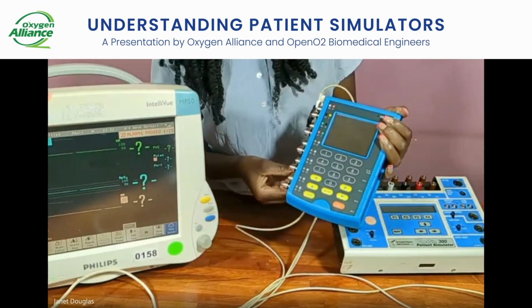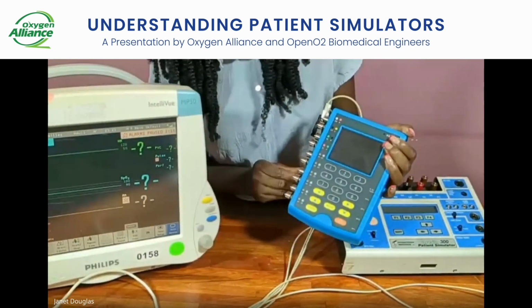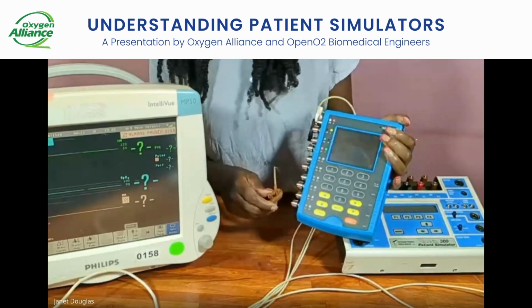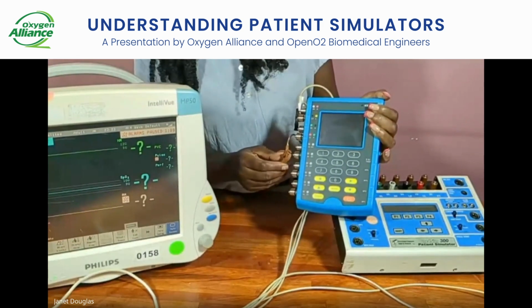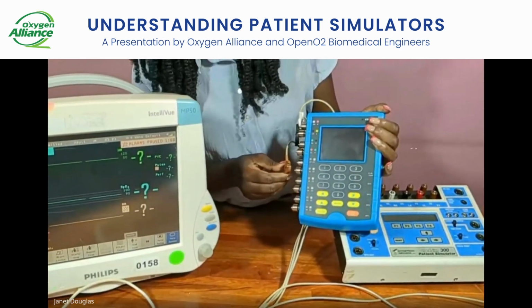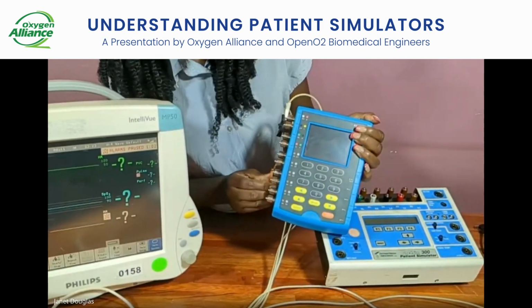The brown one, also it's V, and I'll check as well where it's labeled V. So we have V1 up to V6, which is just showing us different sides of getting the signals when you connect it on the patient. So I can choose to put it as, let's say, V2.